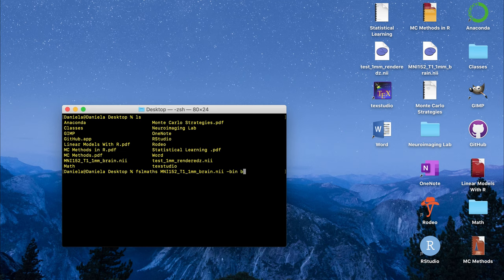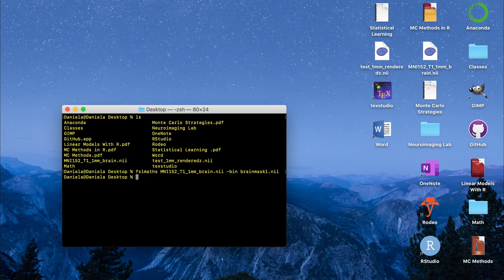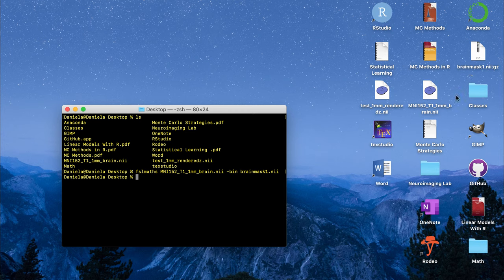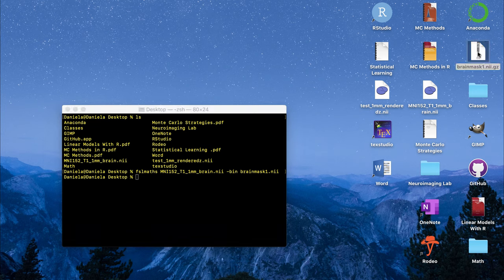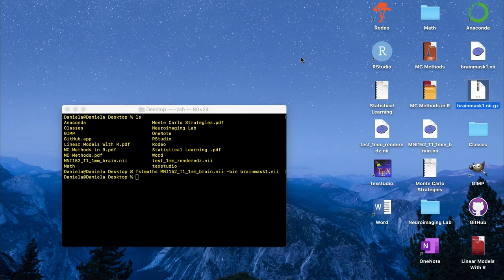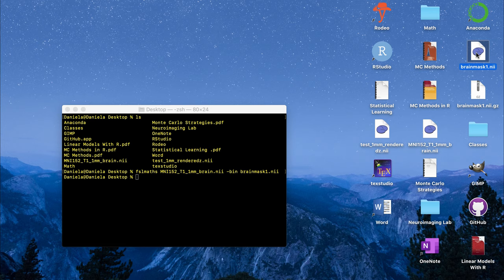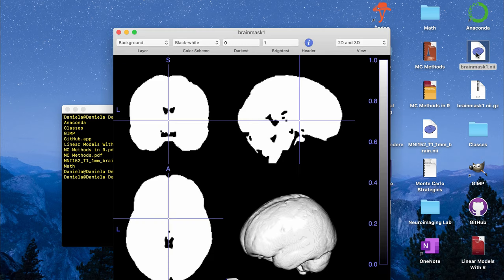I'm just going to call it brain_mask_1.nii and then if you click enter that will very quickly create the binary brain mask. It will create it as a compressed file by default so I'm going to double click that and then here I have my brain mask for the whole brain.